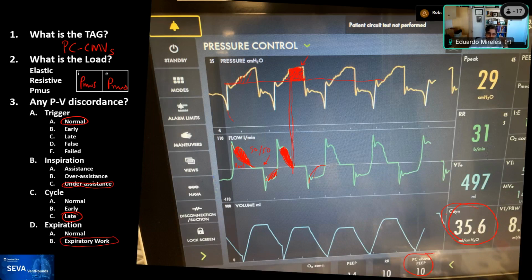So this patient is on 14 of PEEP. I don't know what's the FiO2. But yeah, the quickest way you can easily change this patient is to pressure support. An experienced respiratory therapist can easily also go down on the I time. So very good. All right.